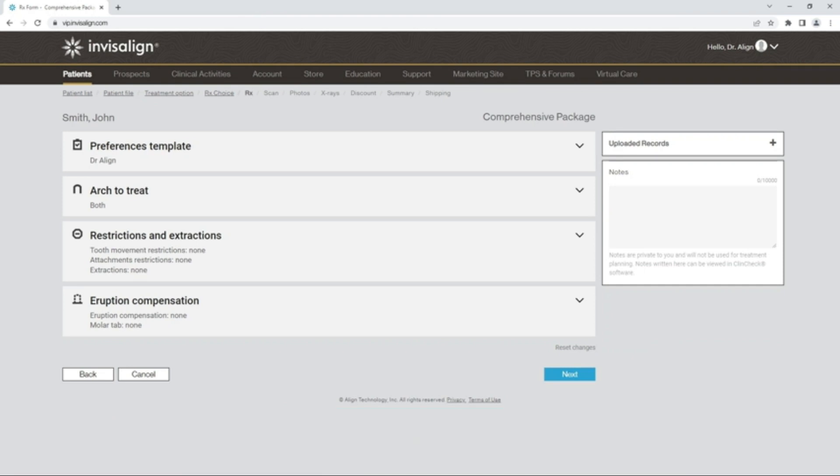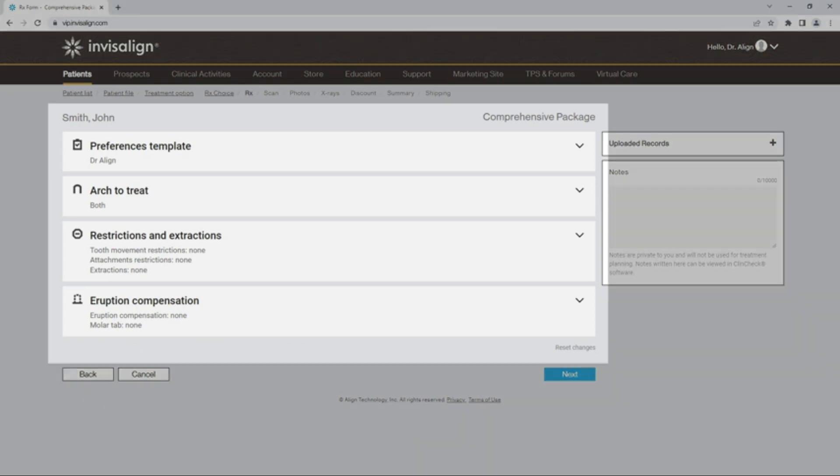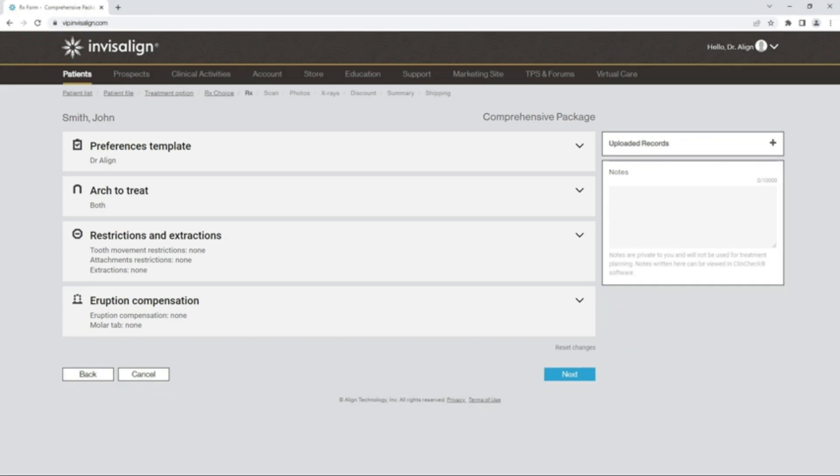The FlexRx prescription form is the replacement of the current MinimumRx form on Invisalign doctor site. It will now be a single webpage which will be used only to submit primary cases using your Preferences template. Selected options are displayed under Section Headers and there are collapsible sections. Let's look closely at how to start using it in your cases.